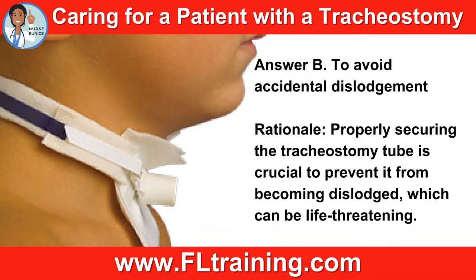So it's hard to see it because we're looking at it from the side, but the gauze that is beneath the tracheostomy tube, that is the tracheostomy gauze. It is actually split in the center so it can go around the tube, and that gets really yucky. So that's the second thing you're going to look at as a CNA.